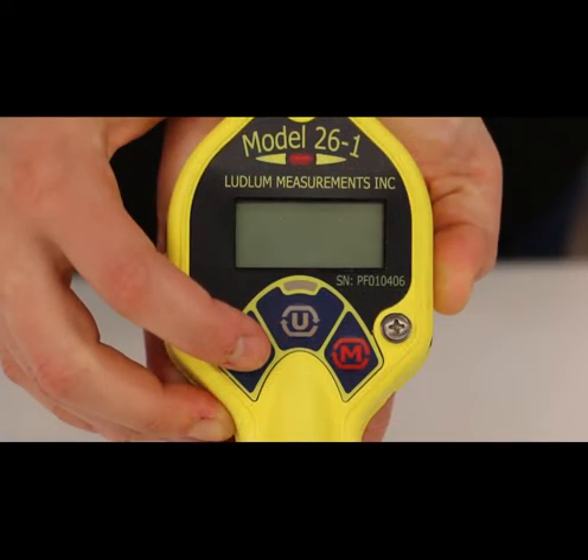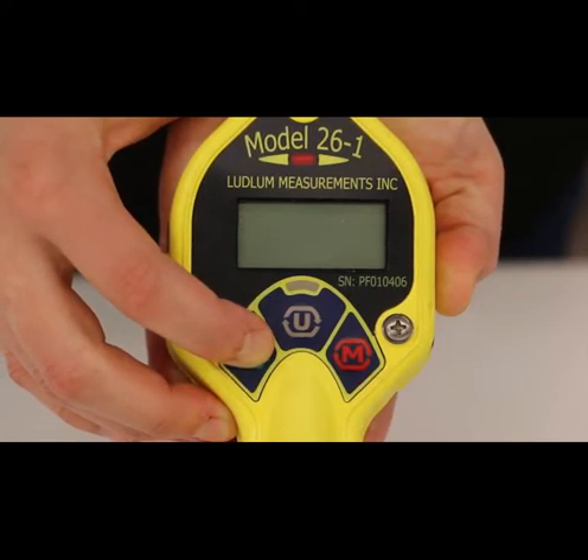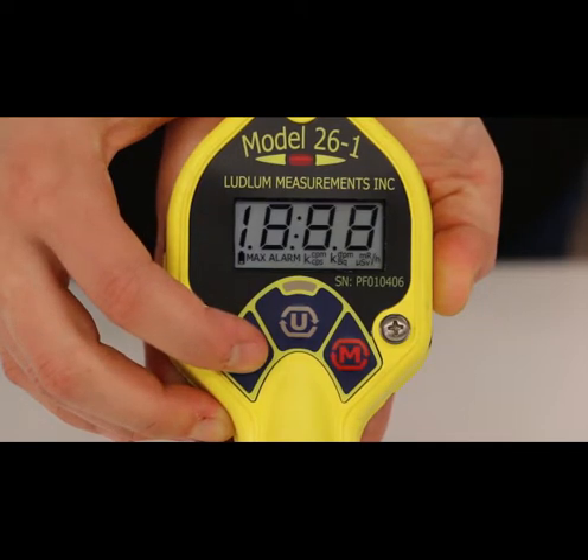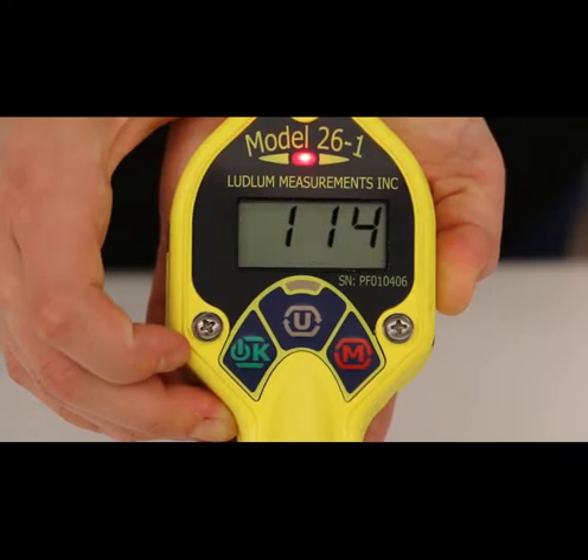This part of the video has been slowed down to show the sequence of events. Turn the instrument on by pressing the OK button. The instrument should activate all of the LCD segments and the audio. If any of the LCD segments are missing, or the alarm LED fails to illuminate, or the audio fails to work, the device is in need of repair.